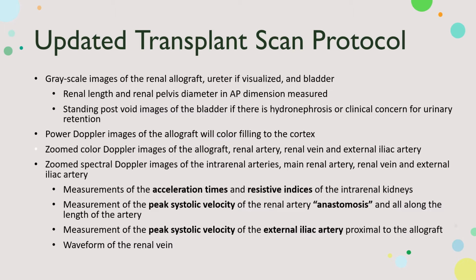If there is any urine in there at all, we're going to have the patient void. They're going to come back, and in the standing position, the sonographers are going to re-measure the pelvis AP diameter.